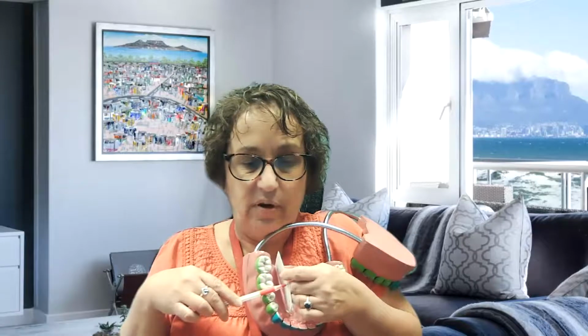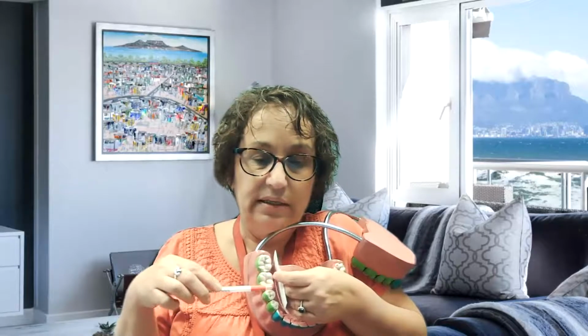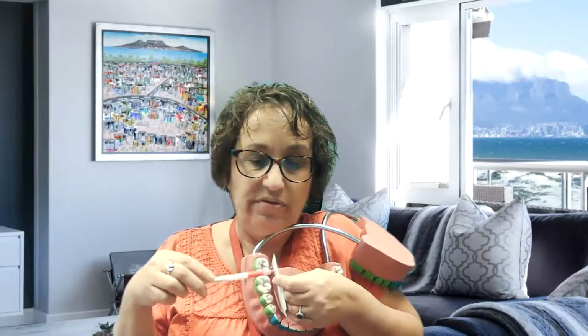If I'm parallel here, and I'm still perpendicular to my film, but my film's not parallel to my teeth, I'm still going to get overlap contacts because now my film's not parallel to my teeth. So everything needs to be parallel to one another. My film needs to be parallel to my teeth, and my PID needs to be perpendicular to my film.